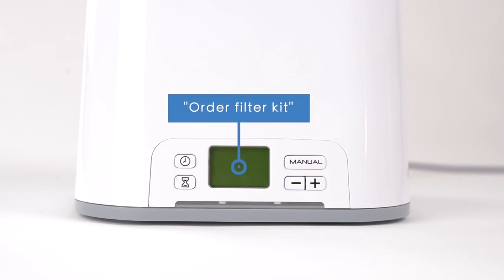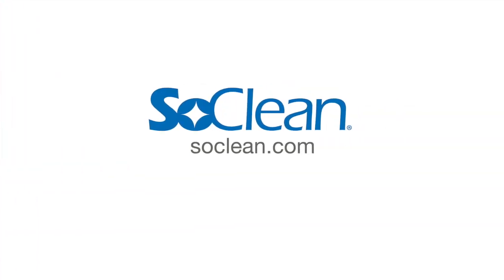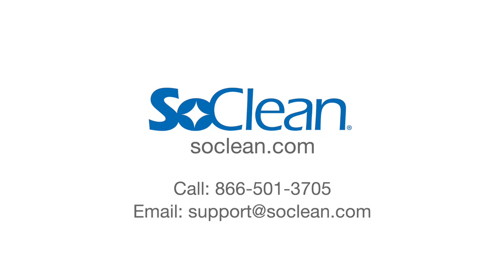"Order filter kit": this message displays after approximately 6 months of use as a reminder to order a replacement filter kit. To contact us, visit SoClean.com, call 866-501-3705, or email support at SoClean.com.